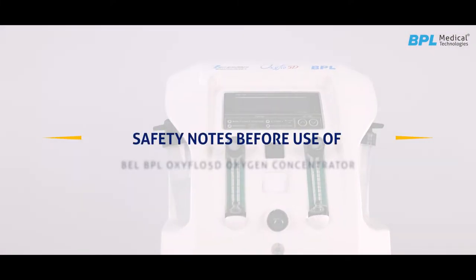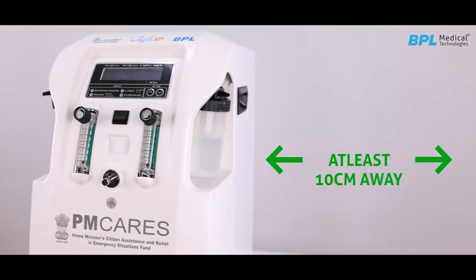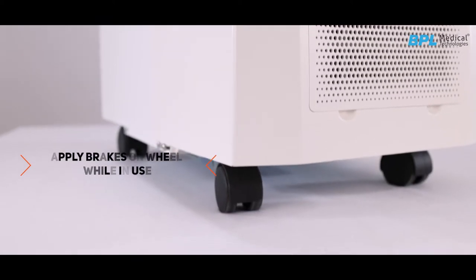Safety notes before use of an oxygen concentrator: place the oxygen concentrator in a room such that all sides are at least 10 cm (i.e. 4 inches) away from walls, furniture, or other obstructions. Do not place the unit in a confined area. Apply brakes on wheels while in use.